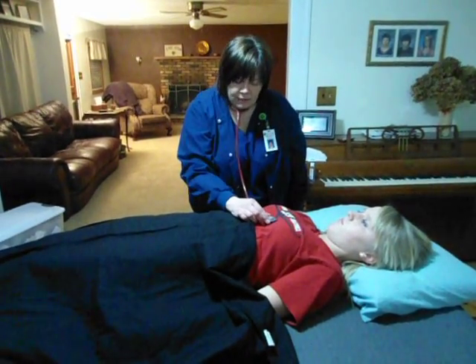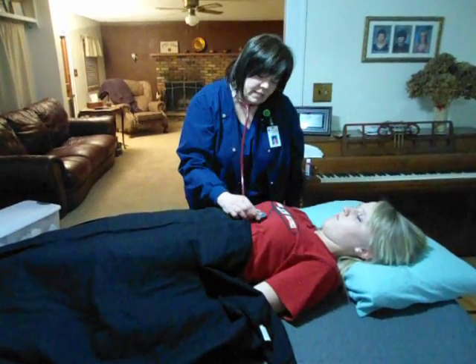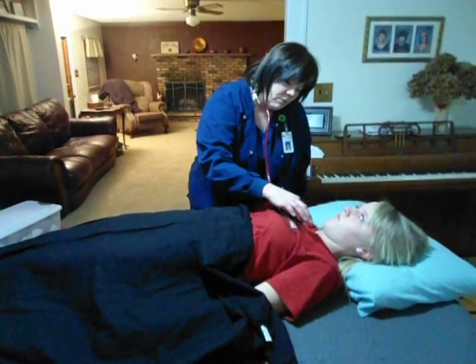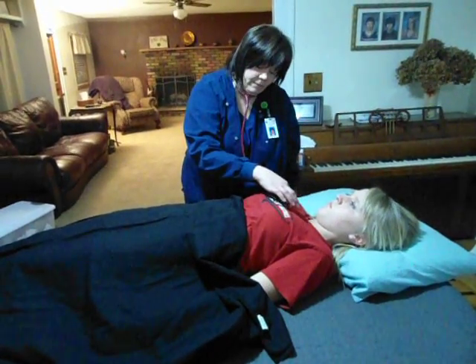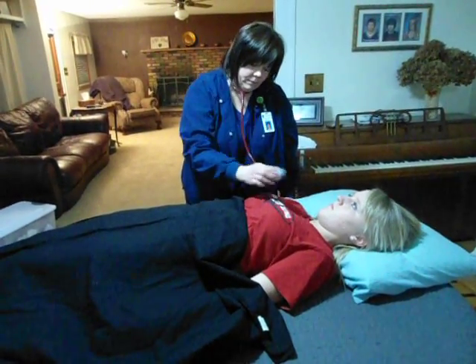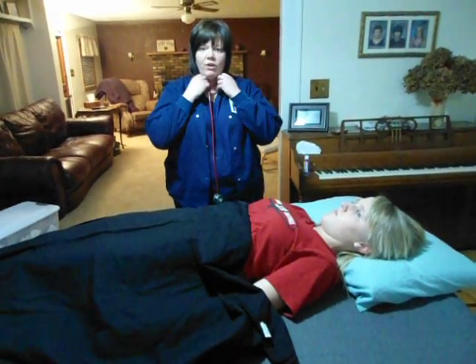I'm going to come up and listen in the next spot. I think that's the tricuspid. I'm going to listen in the pulmonic, and then over in the aortic area. And that's it for my neurologic and my cardiac assessment.